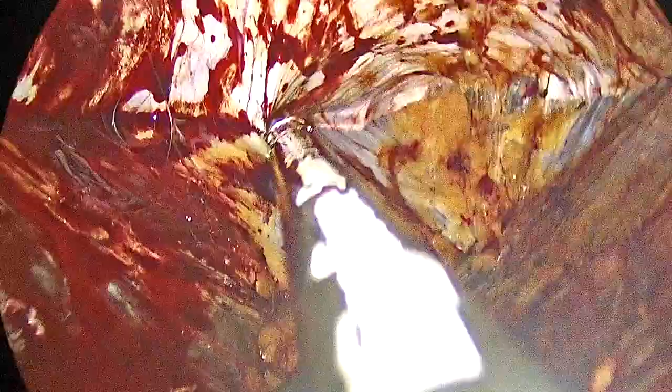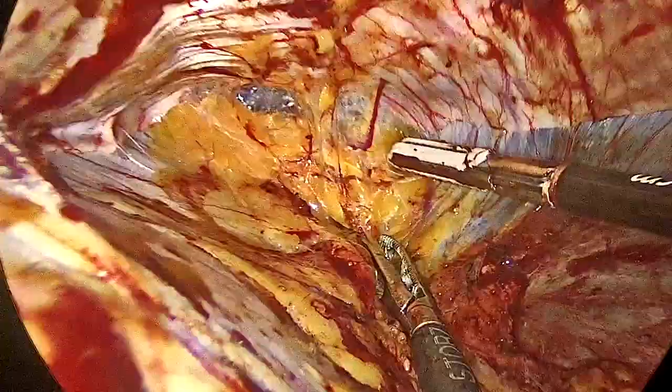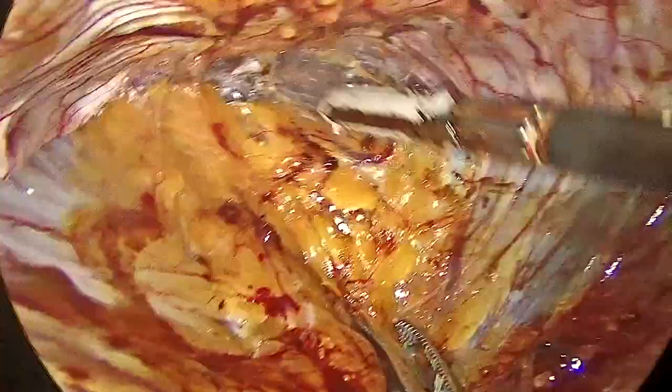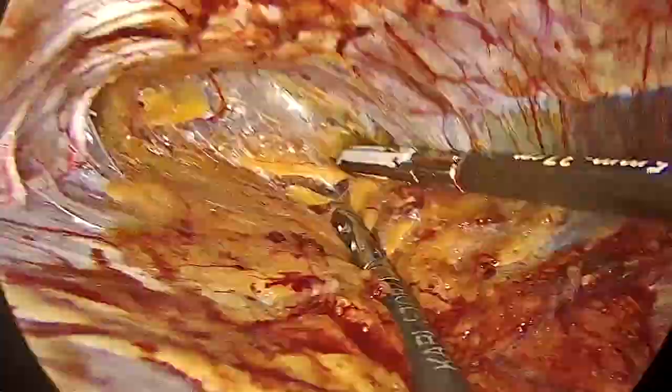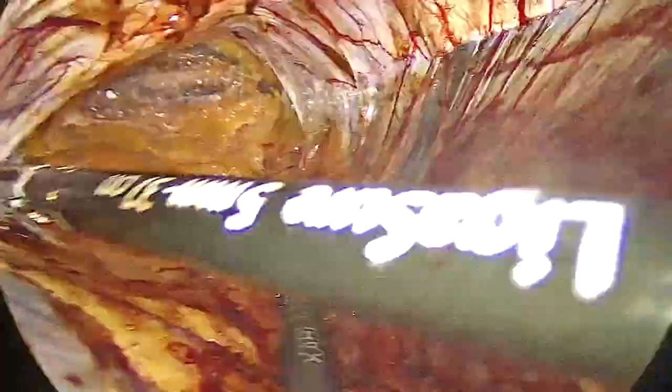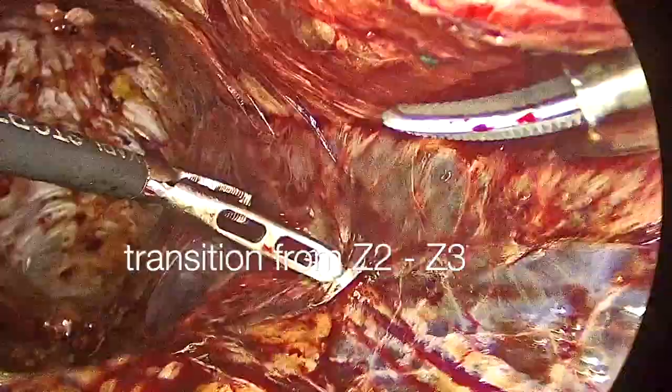While doing this, I am always taking into consideration these small branches of blood vessels that, if not cauterized, are going to make my space a little bloodier and more difficult to work in.